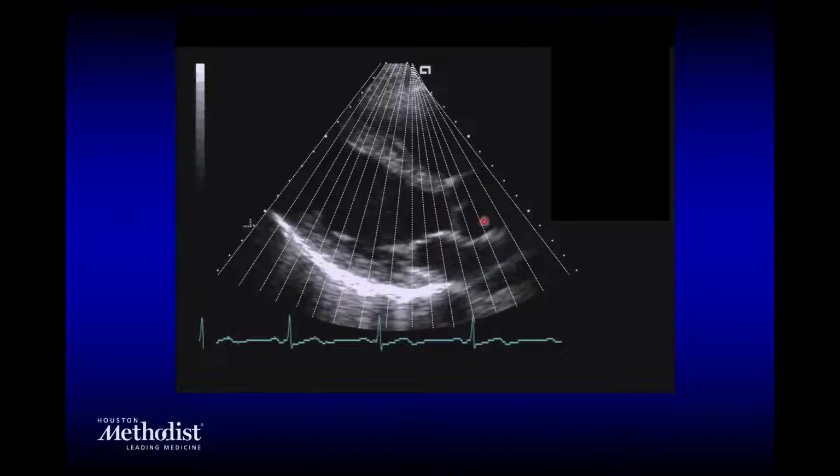So the further away you are from a transducer, the lesser the resolution from a lateral point of view, because of the spacing of these ultrasound beams. Yes, you can focus the beam electronically nowadays, but this is the genesis of your 2D picture.